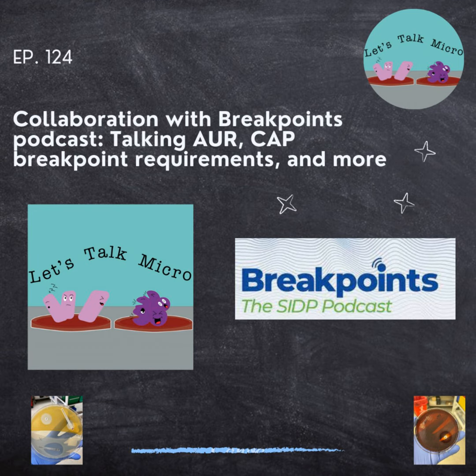And one more thing is that validation of breakpoints is not a common practice. Sadly, it's not a common practice. Validation of new platforms like a molecular diagnostic, a PCR method, validation of a new strip or a disk, validation of a whole antimicrobial panel is probably not as common as we think. A validation of a whole Vitek or Phoenix card or of any other automated system takes a long time. So laboratories are now doing validation for these panels maybe every 6, 7, 8 years. So you try not to change it unless you really need to.